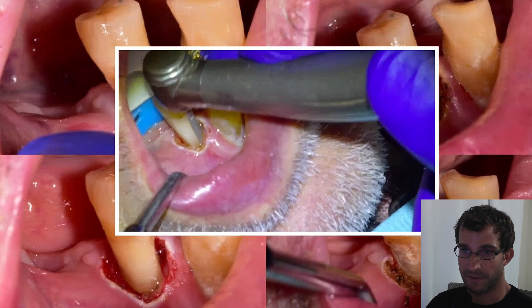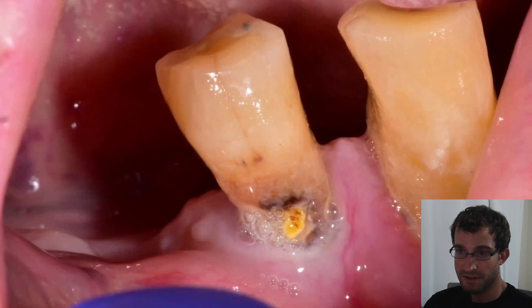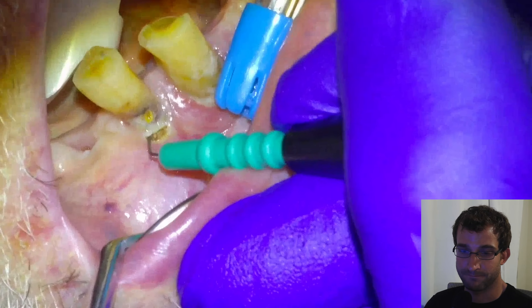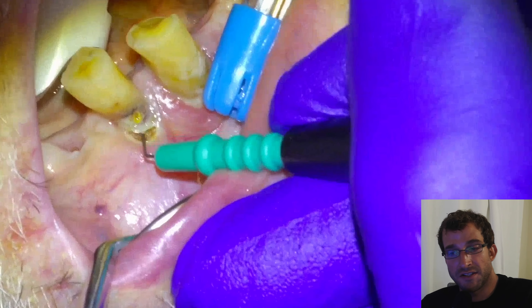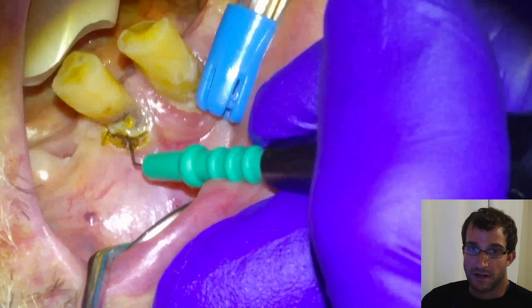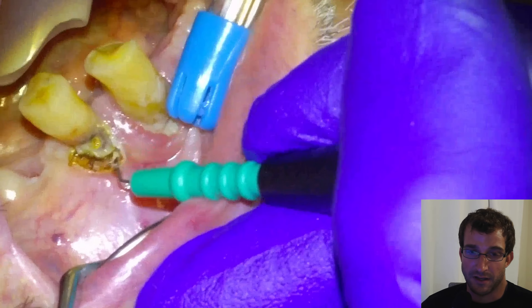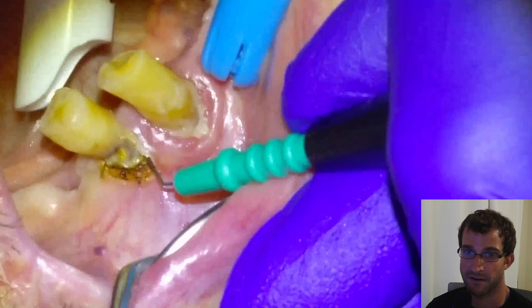And finish it up, so we'll get into the procedure from the start here — there's the tooth. Most people seem to like the non-sped-up and less edited and trimmed format of video, so that's what I'll try to do going forward. For this procedure we would have probably just infiltrated the tooth with some Articaine for anesthesia.